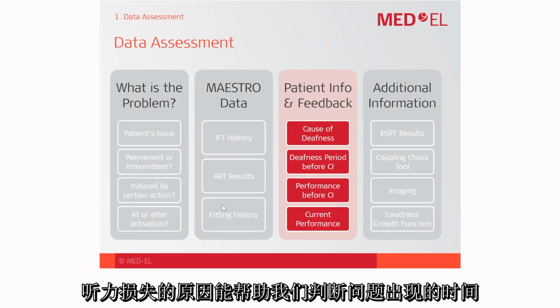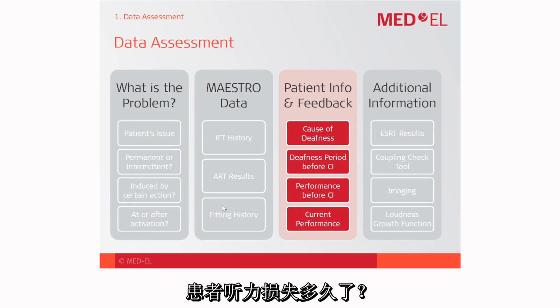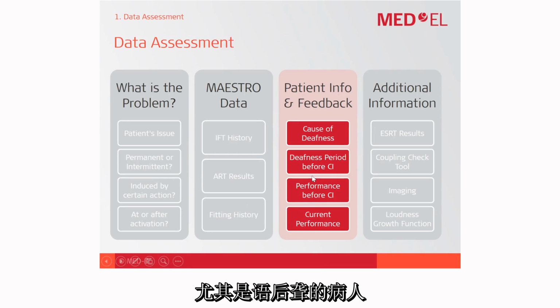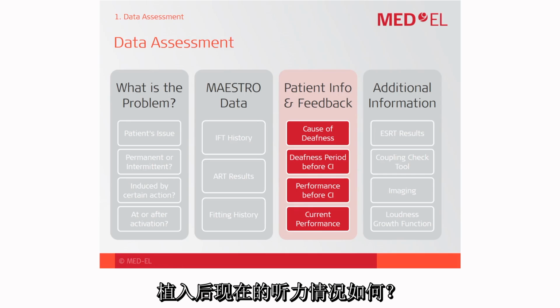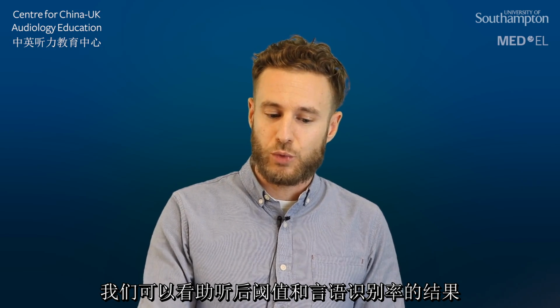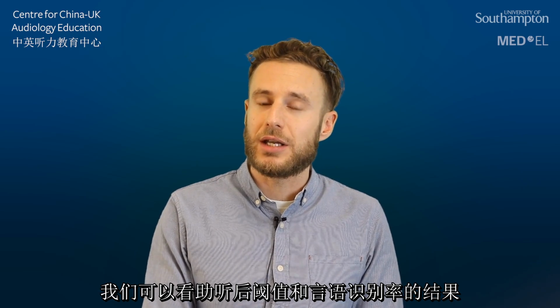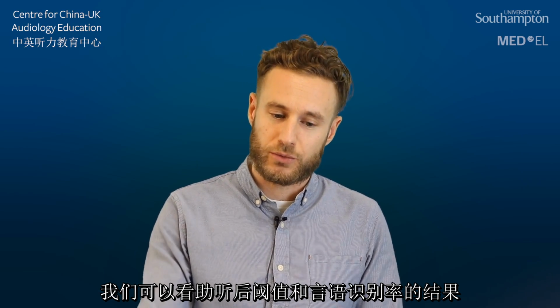The cause of deafness could give us an indication when a problem occurs, how long was the period of deafness, how was the performance before the CI was implanted, especially when we talk about a post-lingually deafened patient, and how, for sure, is the current performance. This would typically include audiogram thresholds and speech discrimination scores.